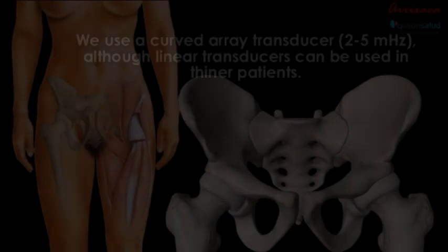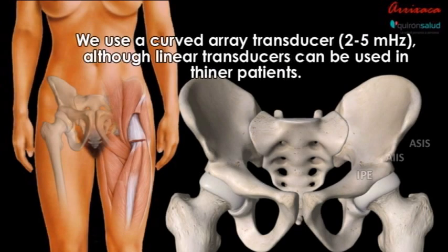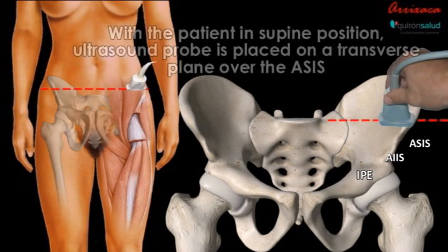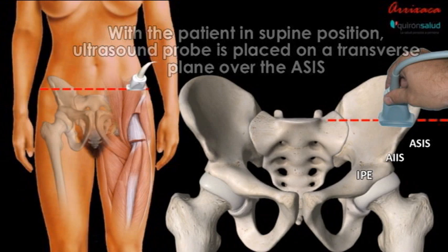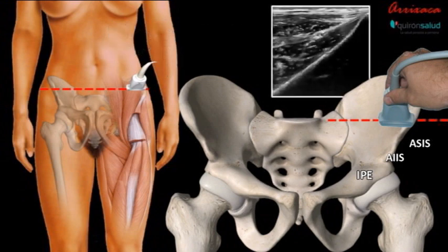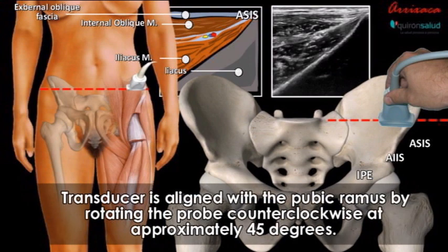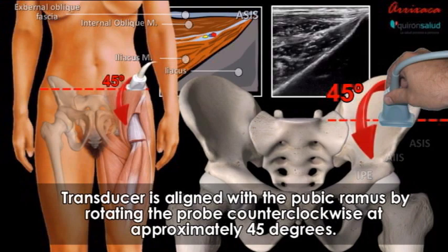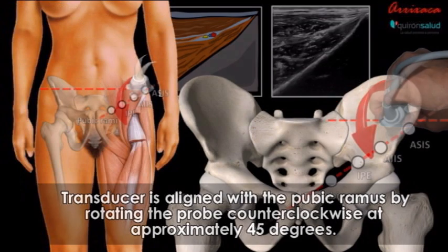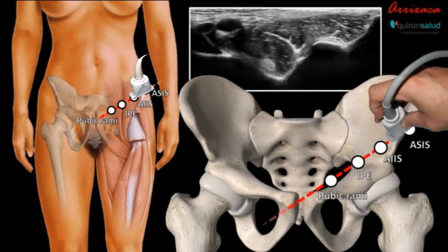We use a low-frequency curved array transducer, although in thinner patients a linear transducer may be used. With the patient in supine position, the ultrasound probe is placed in a transverse plane over the anterior superior iliac spine. Once the ASIS is clearly identified, the transducer must be rotated 45 degrees clockwise for the right, or 45 degrees counterclockwise for the left, aligning with the ASIS, the AIIS, the iliopubic eminence, and the pubic tubercle.